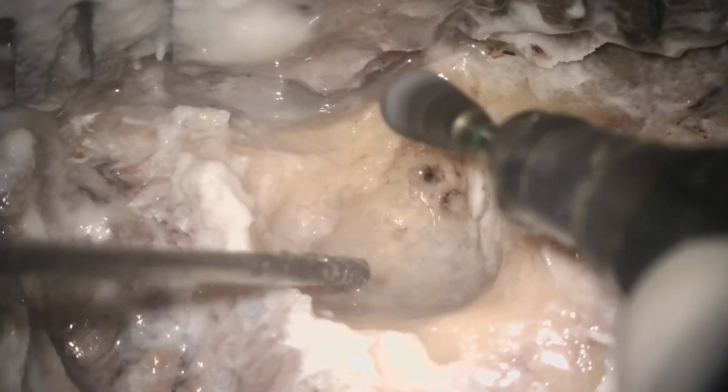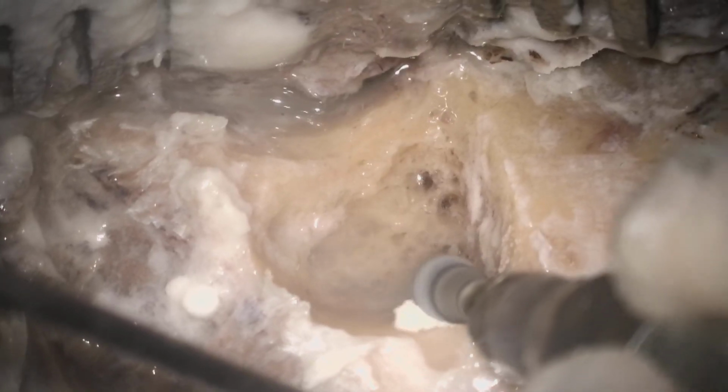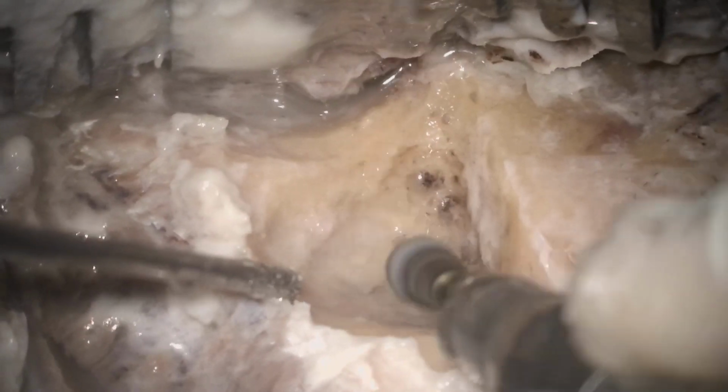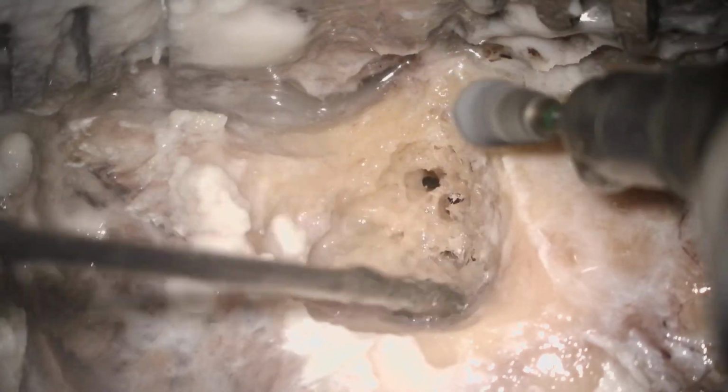So now we are coming to the sigmoid sinus. Whenever you are doing a temporal bone dissection, a few things you should always keep in mind. First thing is the sound. When important landmarks or a hollow structure are coming, the sound of the bur will change. This is the first indication that you are coming towards an important structure nearby.